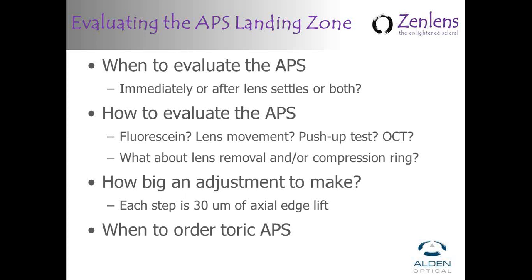Very good. Another question that I suspect may be subject to some debate is regarding lens movement. I've had practitioners call me and say the lens doesn't move at all on the blink, and they feel they need to do something about it. And other practitioners call me and say, I could see the lens move on blink, and they'd like to tighten it up. Is there a movement? Is it good? Is it bad? Is there an in-between of some sort on that, or is it a matter of personal preference?